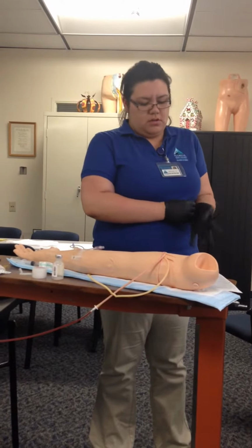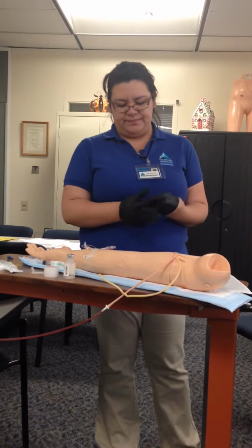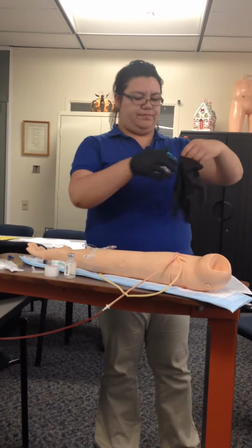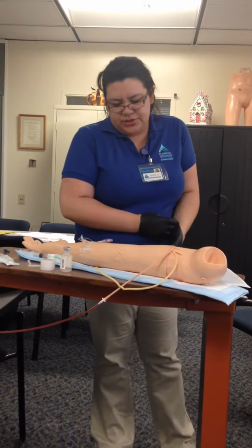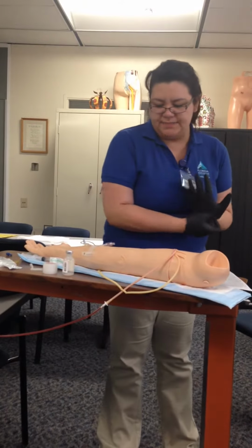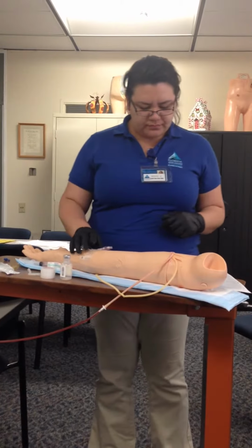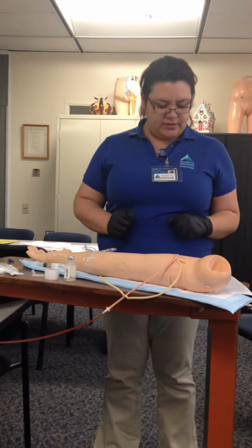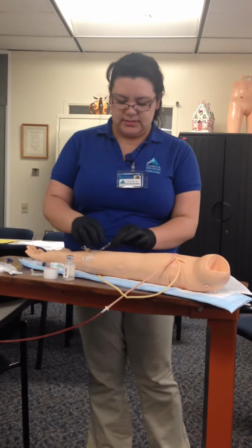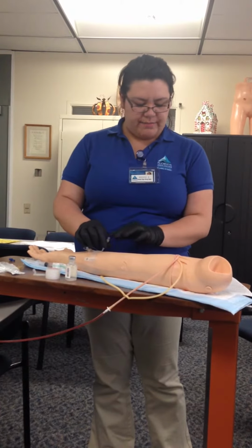I'm just going to assess the site of the IV, make sure that there's no redness, pain, swelling, infiltration, edema. And I'm going to begin the ASASH procedure, which is to aspirate saline, administer saline, and then heparin.